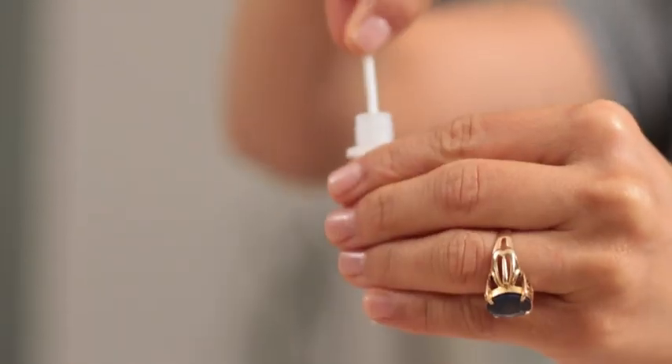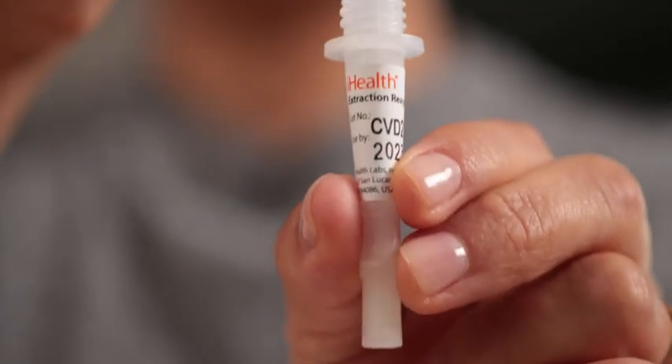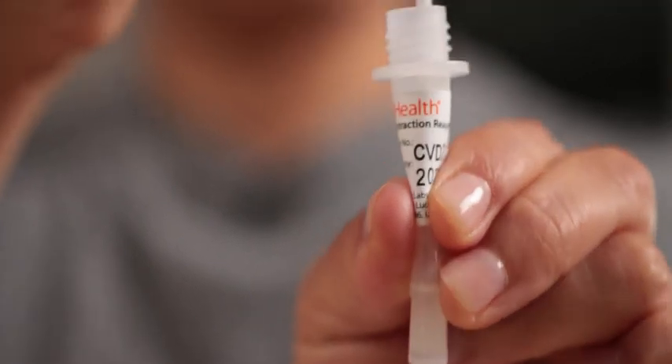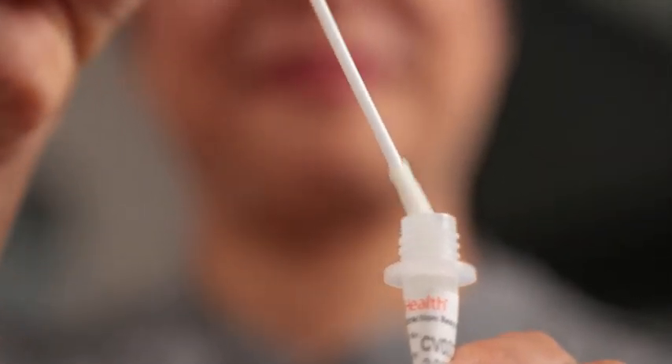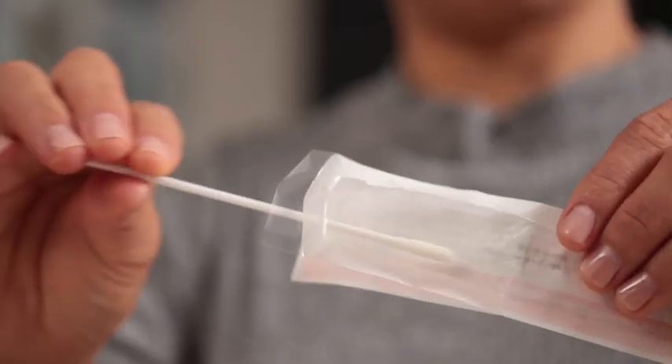Insert the swab all the way into the solution. Twist it back and forth in the solution at least 15 times. And as you're removing the swab from the tube, squeeze the sides of the tube to wring every last drop of solution and sample out of that swab. Then replace the large lid back onto the tube. You can now say goodbye to that swab.